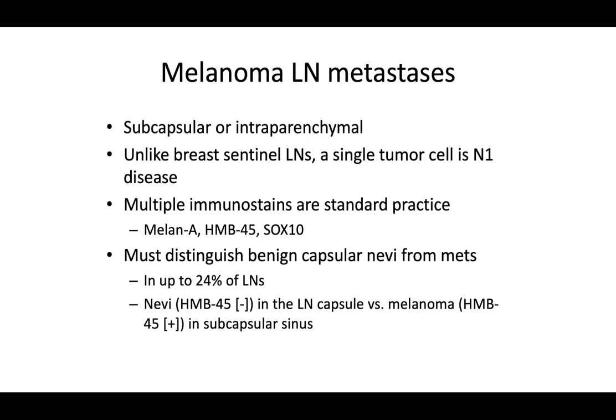And this is still trying to be worked out and understood completely. There will be more information on that coming in the future, I'm sure, with upcoming publications and studies. So more to be continued on PRAME in metastatic melanoma lymph nodes. However, there are some papers out that showed that PRAME is a good marker for confirming metastatic melanoma compared to a nevus.